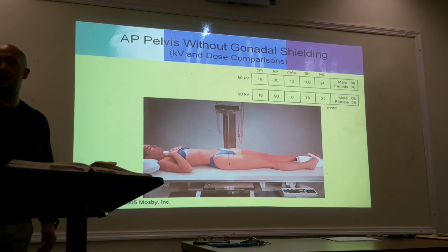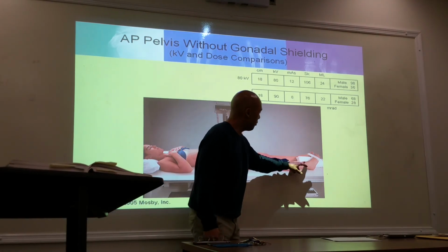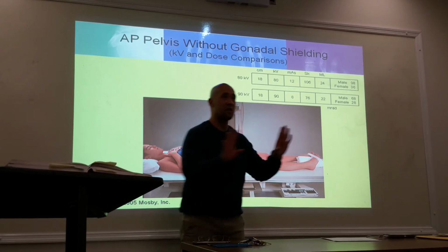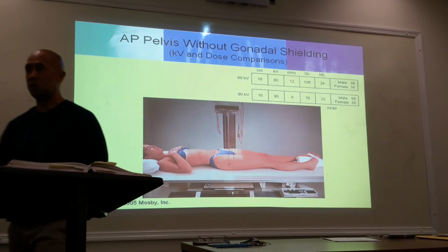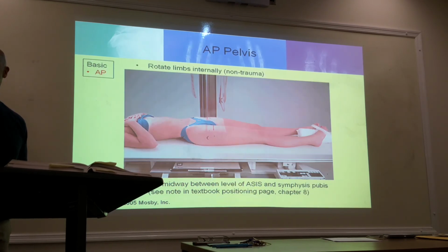And so what we have here is the tech putting a sponge between the legs, and then they take the feet together to maintain that position of 15 to 20 degrees rotation. Like so.